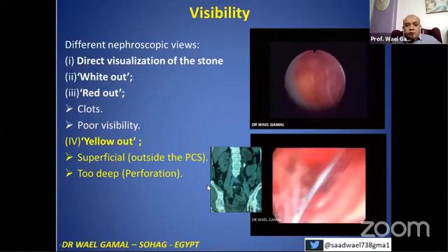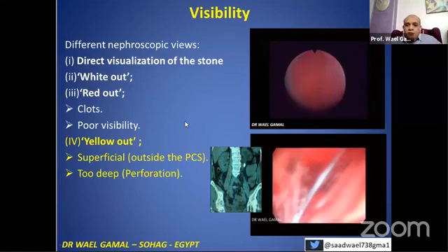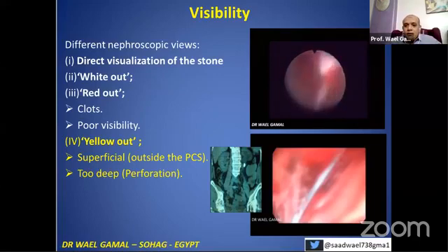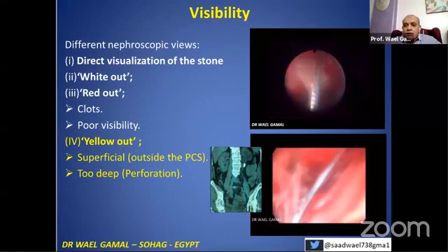There is what's called yellow out. Yellow out means perinephric fat. So you may be outside the pelvicalyceal system, or you may have transfixed the kidney. You can estimate this by the lens with the sheath outside and the guide wire inside — you see the yellow sign, the perinephric fat outside the kidney.